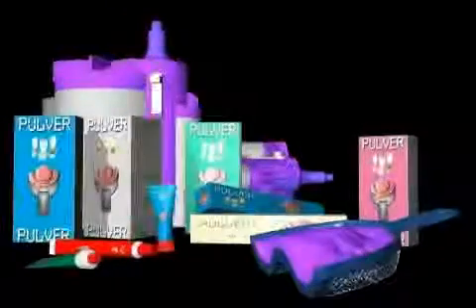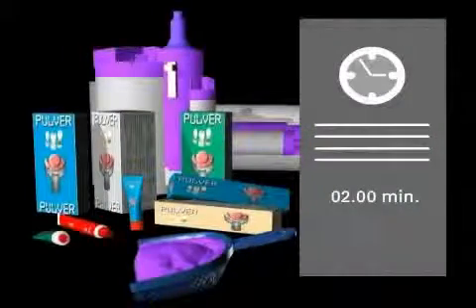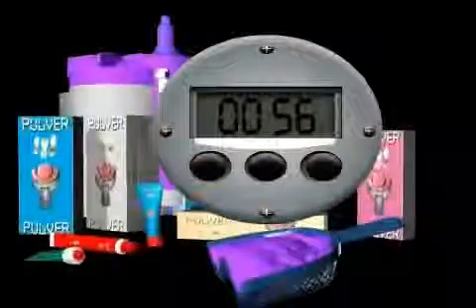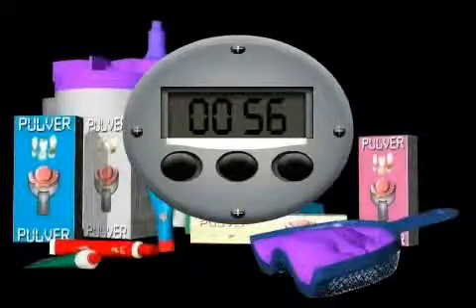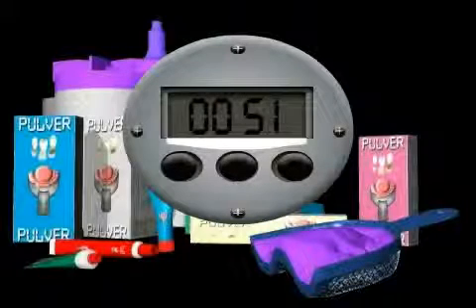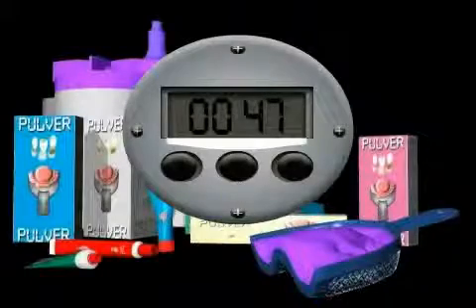This is why it's important that the dentist or dental technician adhere to the setting time of the respective material as specified by the manufacturer. Therefore, a conscientious dentist and/or dental technician will always be very careful with their timing, perhaps working with a stopwatch when taking an impression, for example. But it's not just observing setting times that's crucial for a good dental prosthesis.